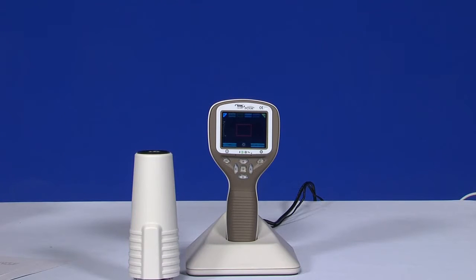Constant illumination can be selected from the device menu if mydriatic drops are used. Pictures can also be taken using infrared light for both aiming and capturing.